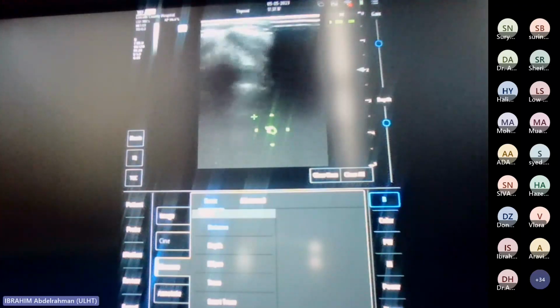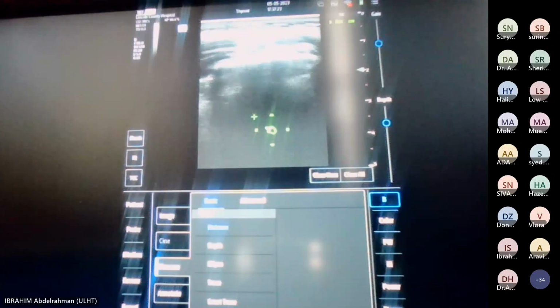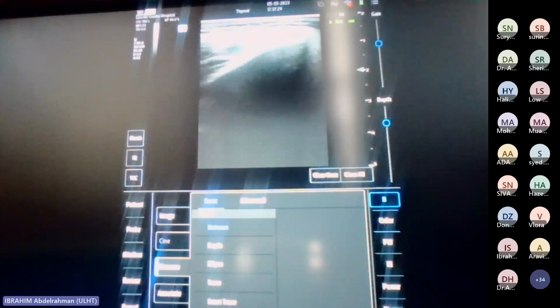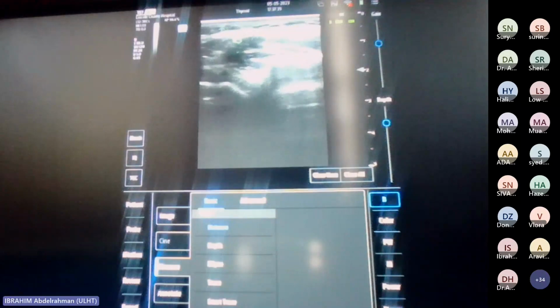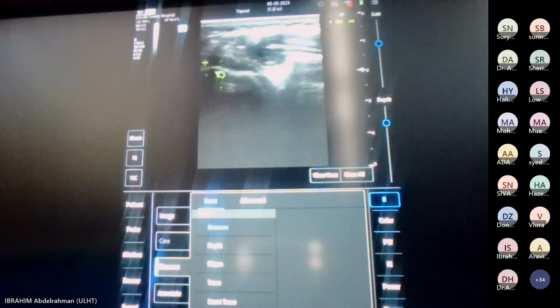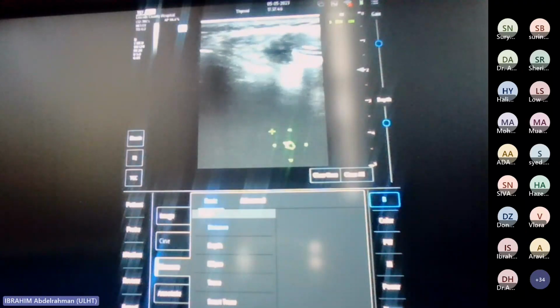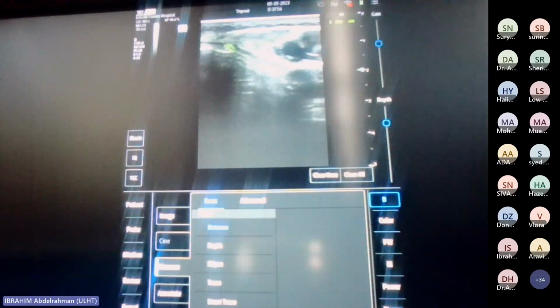As we come back up and back towards the parotid gland, we can also see the masseter muscle here. So if there was any duct dilatation from the parotid gland, you would see a dilated duct sitting over the anterior aspect of the masseter muscle. And that drops off just at that free edge of the masseter and then pierces the buccinator, which is this muscle here. You just blow air into your cheek for me. So you can just see a tense buccinator muscle here. Just blow a bit more air for me. And then some air against the mucosa, which is the white line. So the black line is the buccinator, the white line is air against the mucosa.